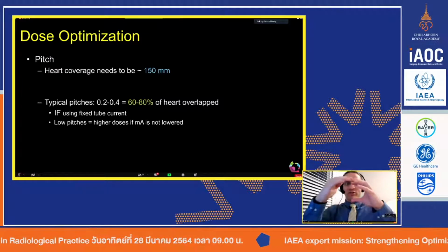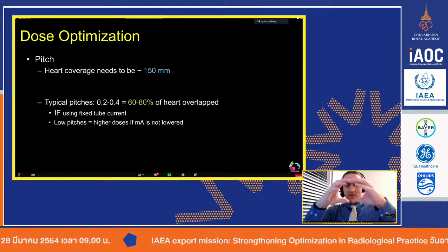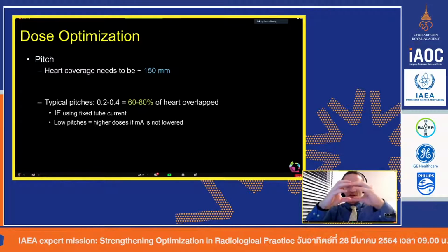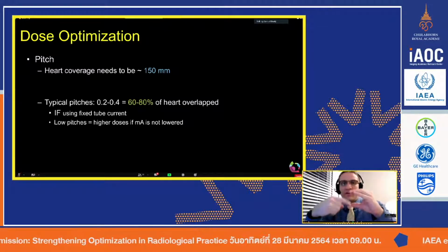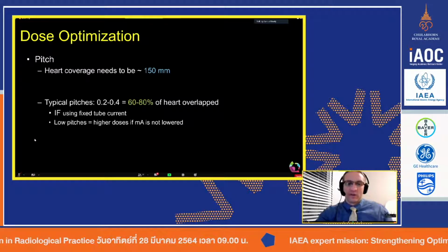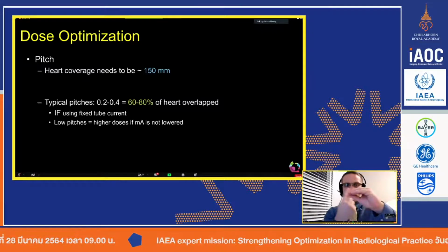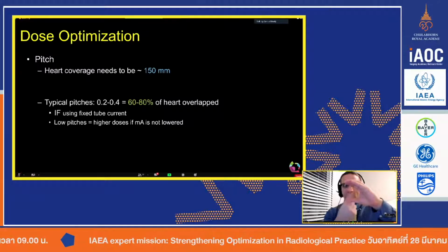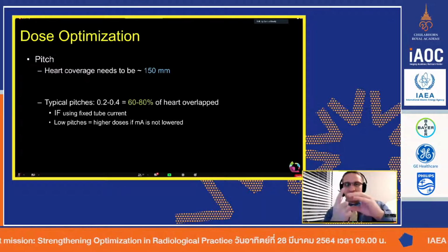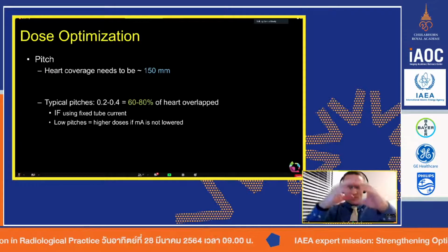And so if we just simply go straight down through it as fast as we can, we're not actually going to image the heart perfectly stationary. It's going to be compressing. It's going to be going from systolic to diastolic. So we actually go the opposite route. We go as slow as we can when we do helical imaging. We do very low pitch, 0.2 to 0.4. So it's sitting there spinning as the heart is beating, and it's able to then sample the heart all the way through its full cycle, systolic to diastolic, one heartbeat. It's able to cover that as it then goes over the whole physical aspect of the heart.